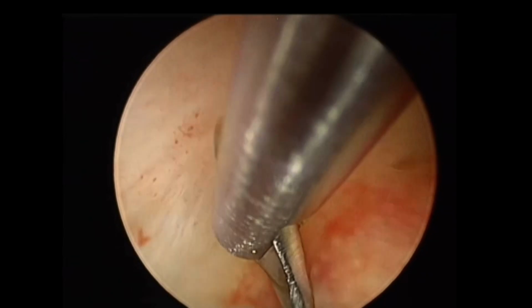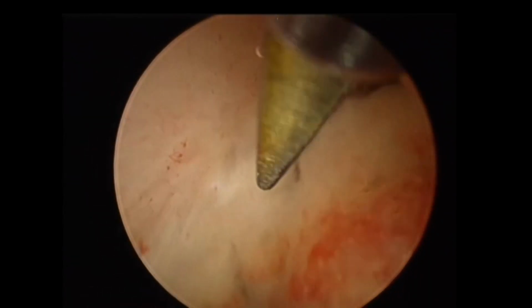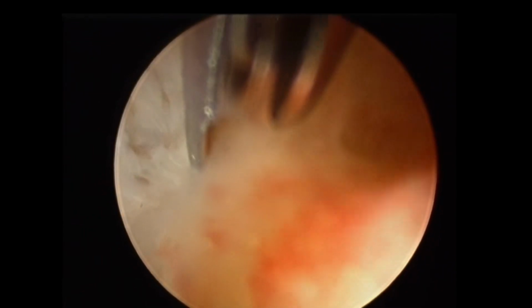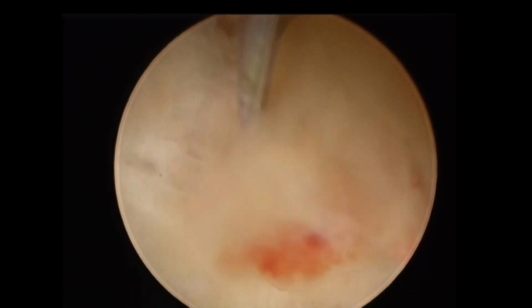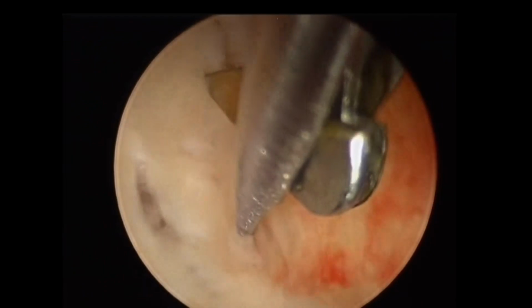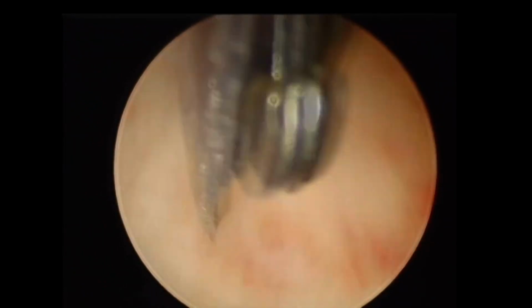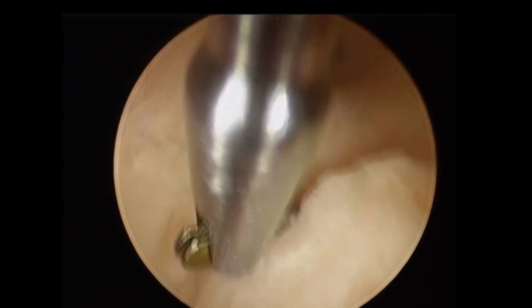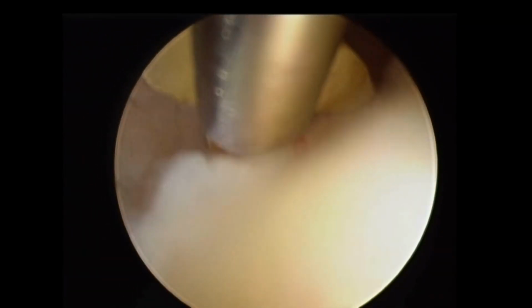It helps to push and get the polyp away from the view, and then you can reach the area to cut. So this is the polypectomy, cutting the polyp from the base. And again, this is the real-time procedure. Enjoy it until we go to the next nice procedure, which is PRP.